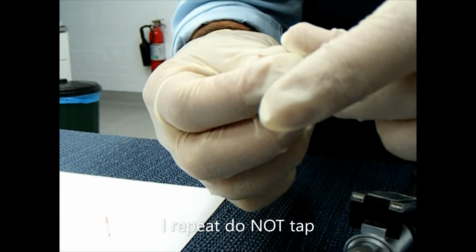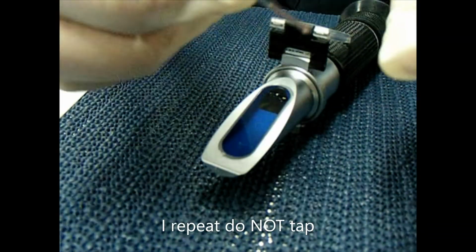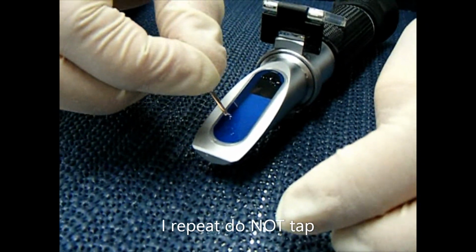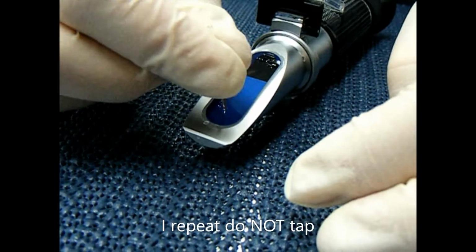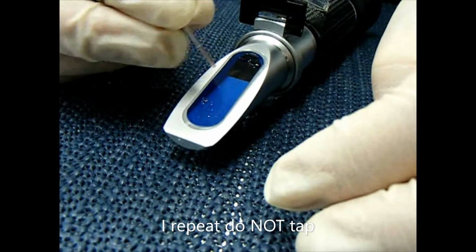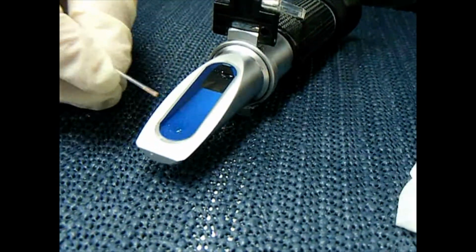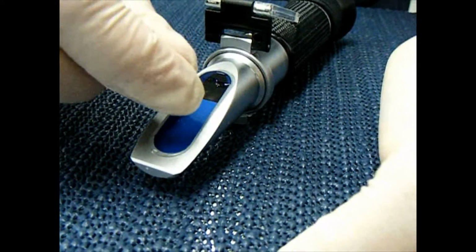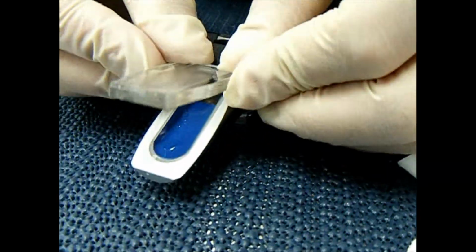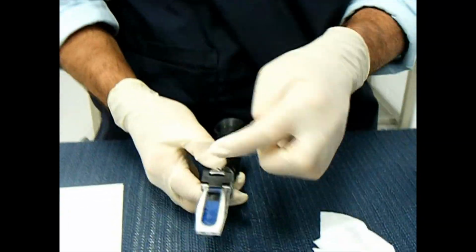This one does. So you can get the plasma to run down either way. Sometimes it's better to make it run all the way down the tube to the clear bit where it hasn't broken. I'm just going to try to get this one done fast. Now you can see here, there's a big chunk of glass on the pane, so I gently move that off. You don't want that, so I've moved that out of the way. So this is why it's really important that you spin down 4 tubes or 6 tubes, a lot of tubes, because when you push the glass pane down, if you don't get a really good seal here, when you look down the refractometer, you won't get a reading. So I can't read that, so we need another 2 tubes to do it.